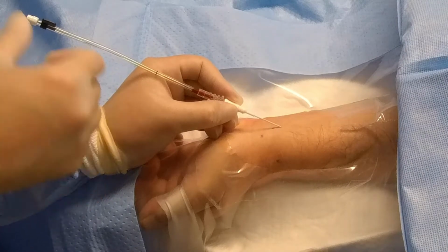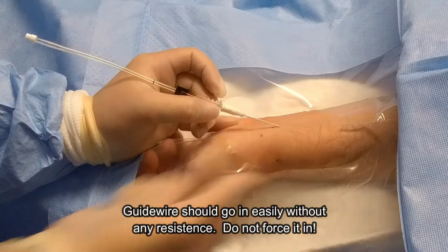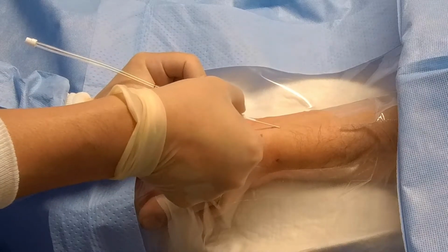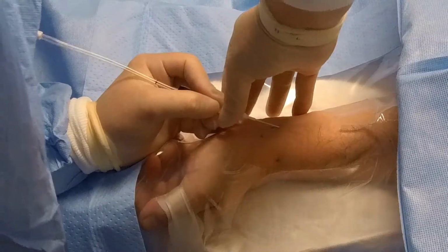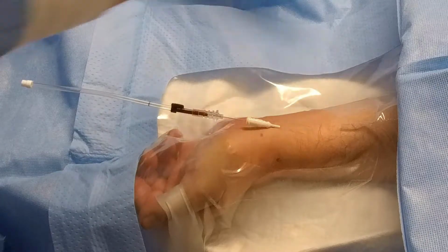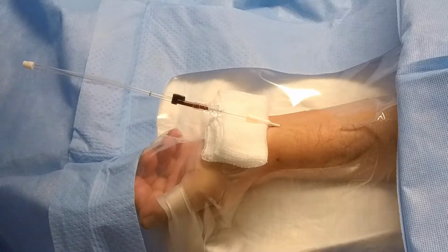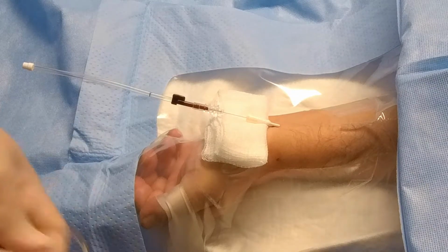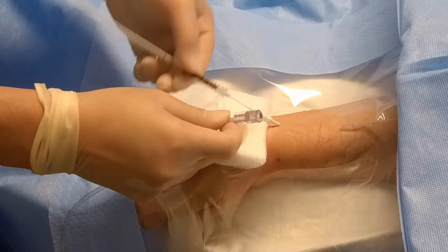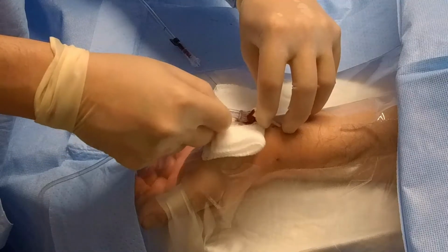Okay. Good flow. Push your guide wire in. Alright. Now what we're gonna do is twist and push. Hold one hand on this side, hold the other hand on the catheter, twist and push. Okay, what I'm going to do is take a cup of gauze, put it underneath the catheter, get my tubing, pull the needle out, and hook up the tubing.